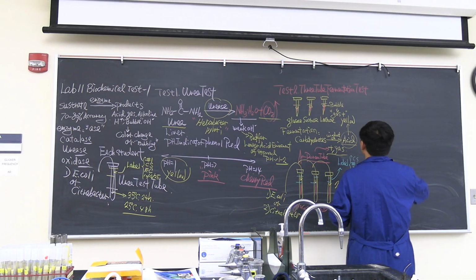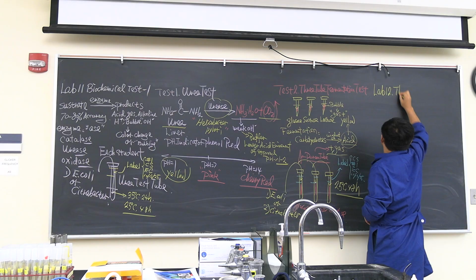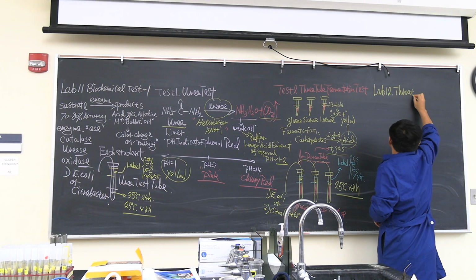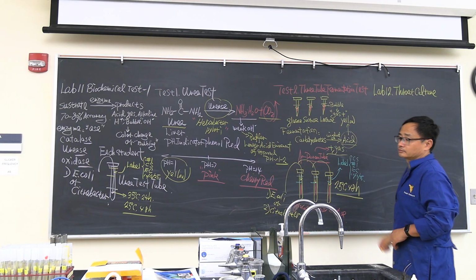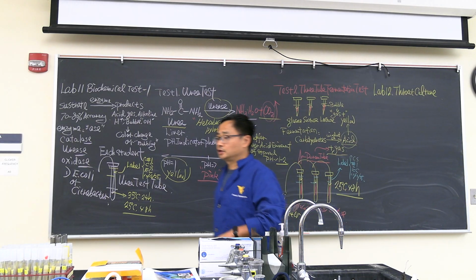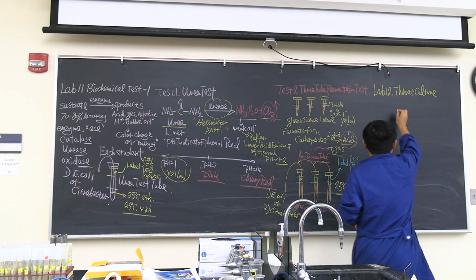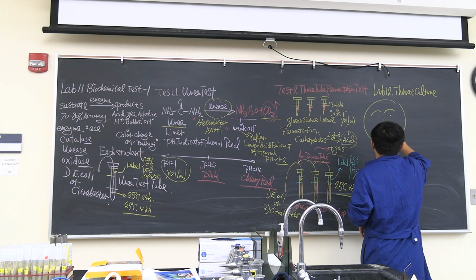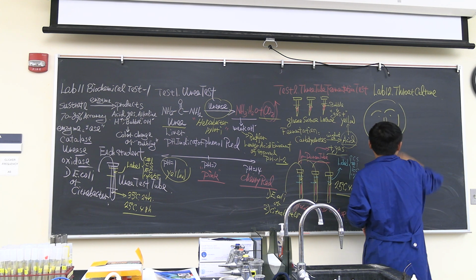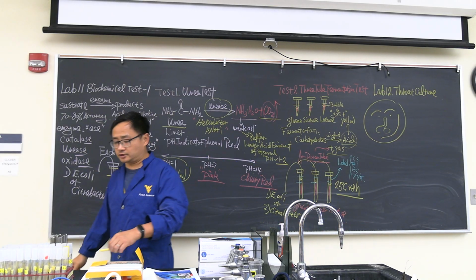This is actually lab 12. How are you going to do it? 2 of you are going to work together. One is a nurse, another one is a patient.